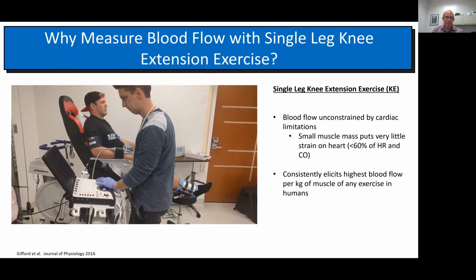So we'll apply all these same principles with ultrasound during active exercise. And this tells us, again, how healthy the arteries are, how much blood flow they can accommodate, and how much exercise they can do. If you can increase blood flow to a person's leg, there's a good chance you can increase their exercise capacity. Not always, but there's a pretty good chance you can.